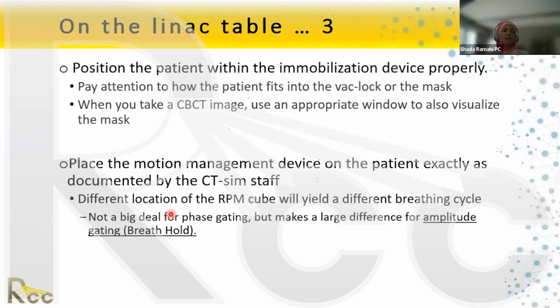I don't have experience with ExacTrac. If ExacTrac does a 6-degree couch alignment and you do CBCT, then this should be enough. I want to see a volume image, and I want to be able to correct in rotation, roll, and pitch. Whatever the ExacTrac couch is doing, if it gives me a rotational correction in all three directions, and I have the CBCT from the linear accelerator, then this should be enough.